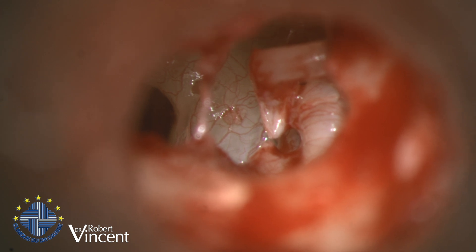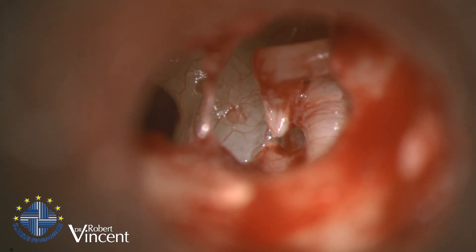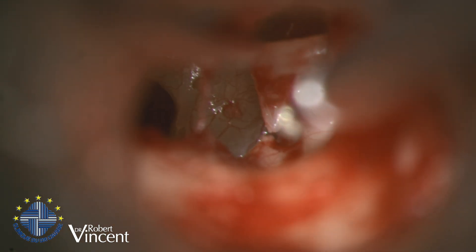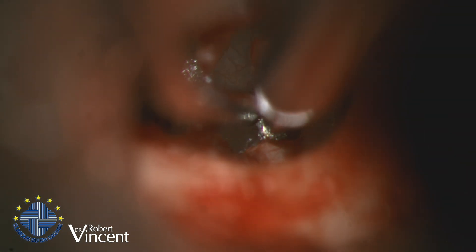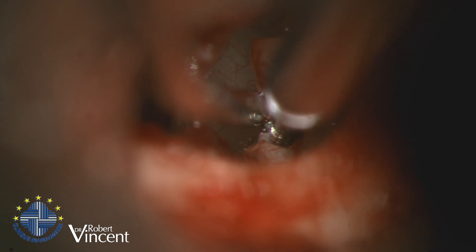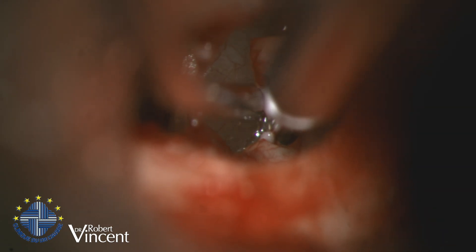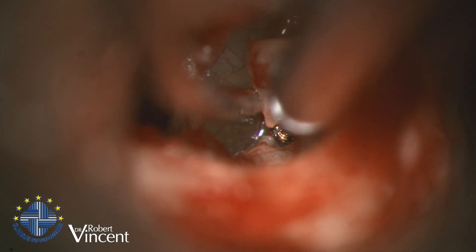The main problem will be the anterior crux, which is completely hidden. I'm going to use the micro drill with the 0.7 millimeter diamond dust burr. I must stay in this position avoiding the facial nerve, taking my time and letting the diamond dust do the job by itself without any pressure. I'm not in contact with the facial nerve, so it's fine.